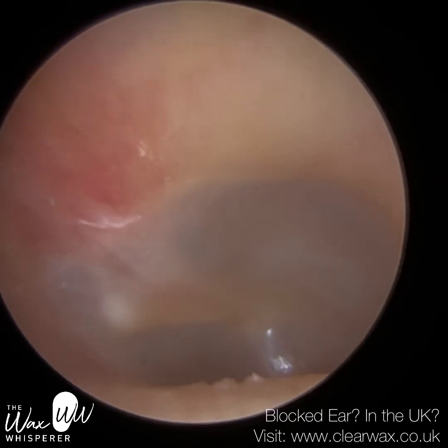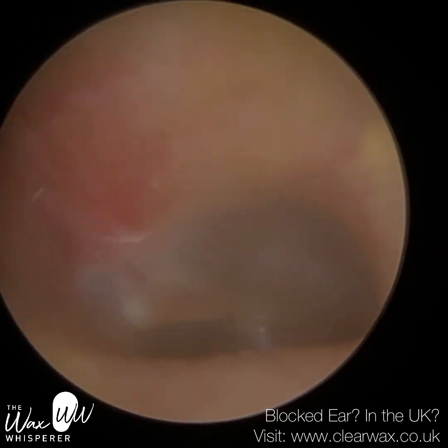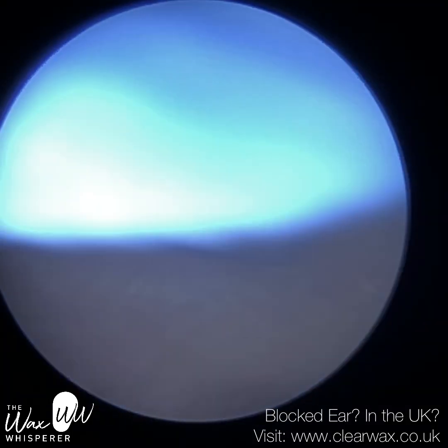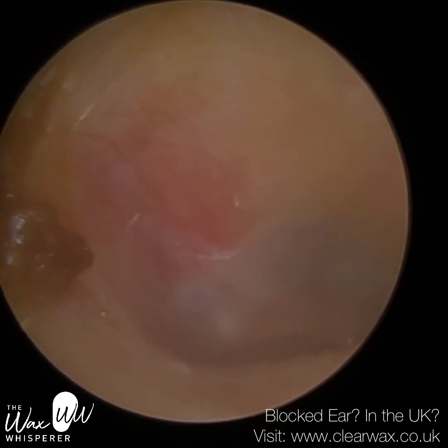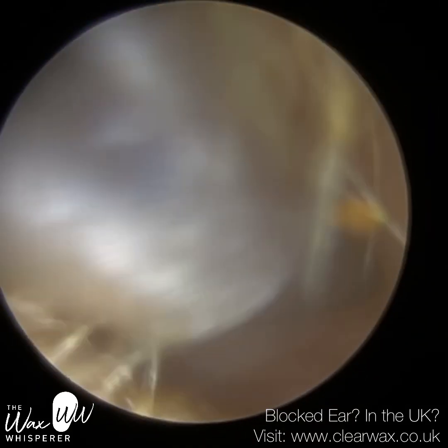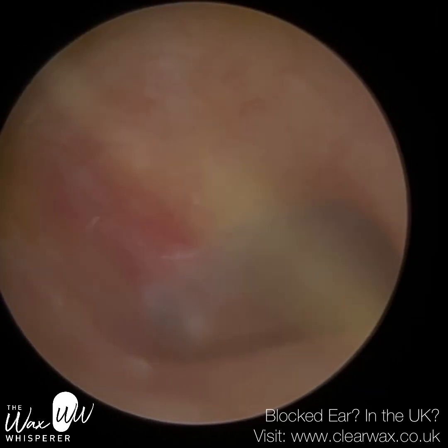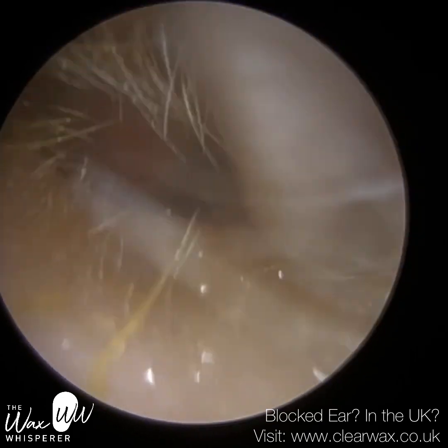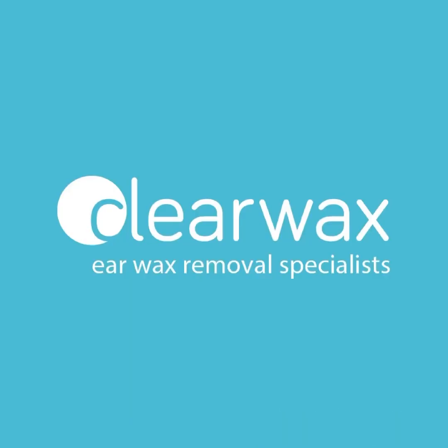So this patient's got a very prominent anterior recess. Behind that canal wall, there's a big recess. The wax can get trapped behind that. So just a little bit of wax just on the anterior superior canal wall laterally. When we say anterior, we mean the front part of the ear canal. Superior is the roof, and laterally is near the entrance. So when we discuss the ear anatomy, we use these terms.